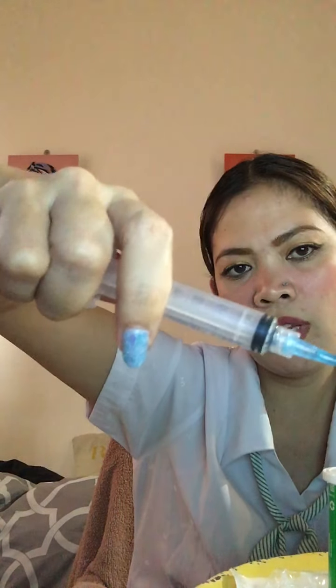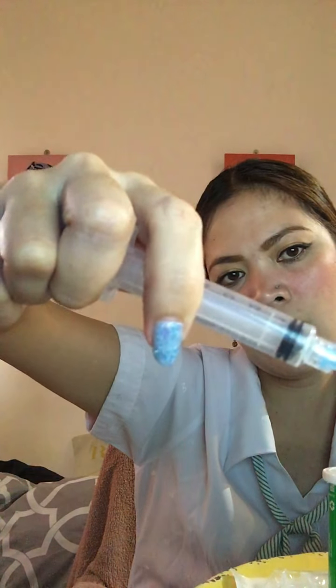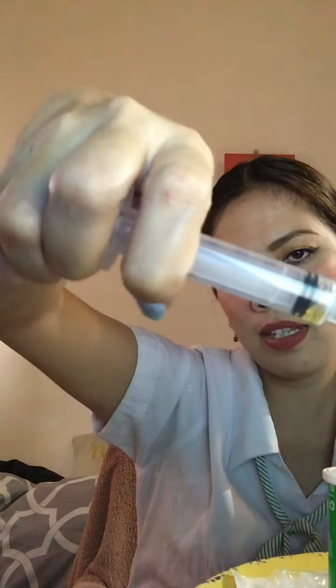So you have to carefully hold it like this, not like this, but like this.